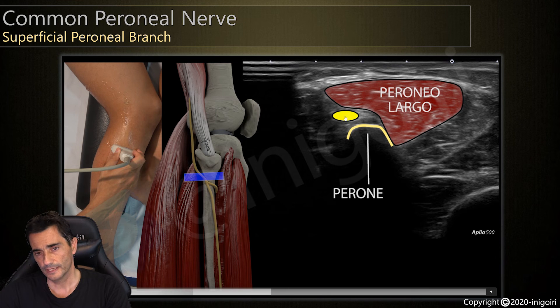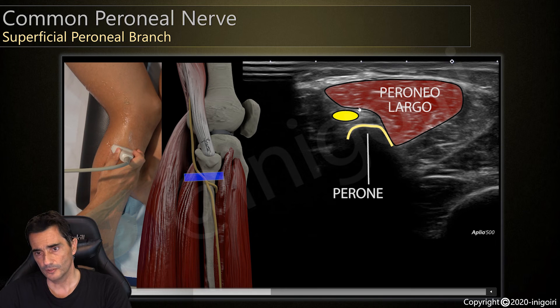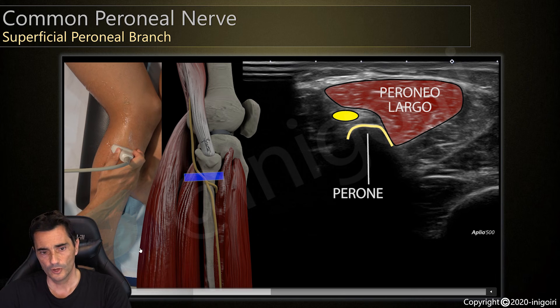The peroneal tunnel is the entrance just below the peroneus longus muscle and above the head of the fibula. At this level we are still following the common peroneal nerve.